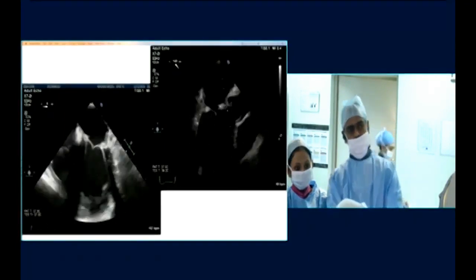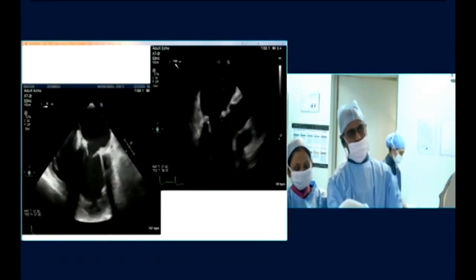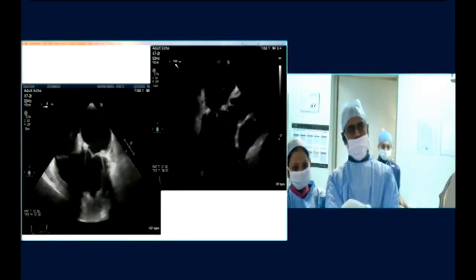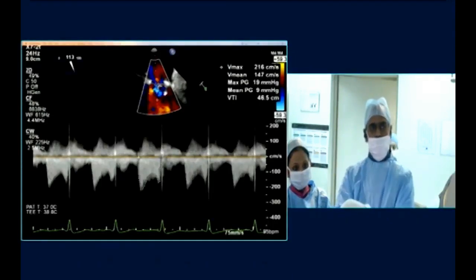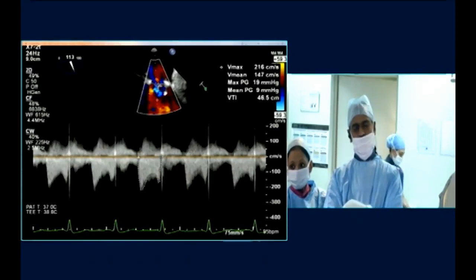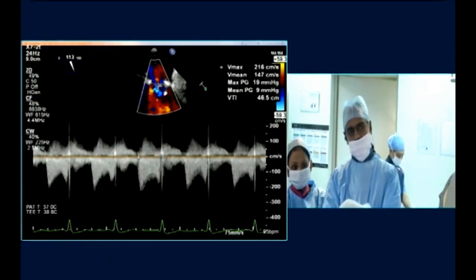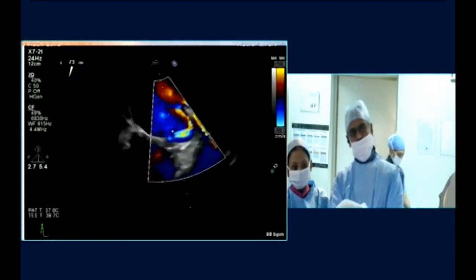This is the echocardiogram — you can appreciate the mitral prosthesis valve leaflets moving very well. This is the mitral gradient, which is marginally increased due to additional blood flow going through the mitral paravalvular leak. This is the paravalvular leak located laterally.